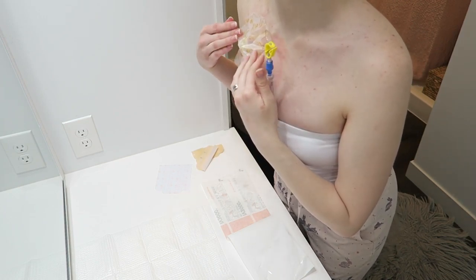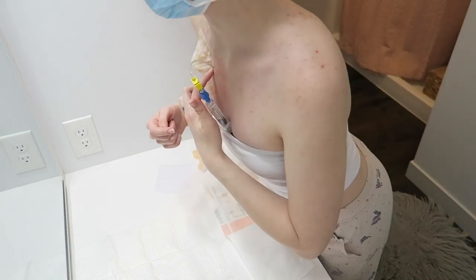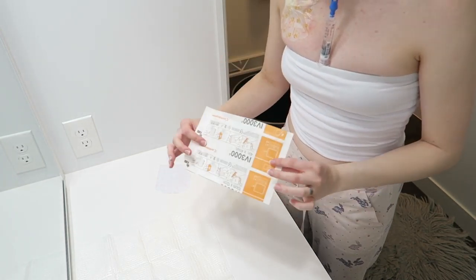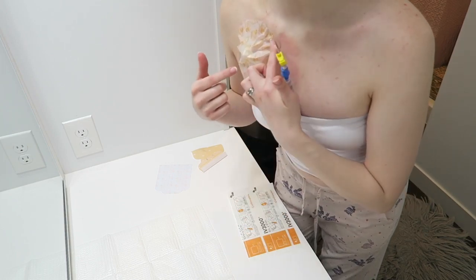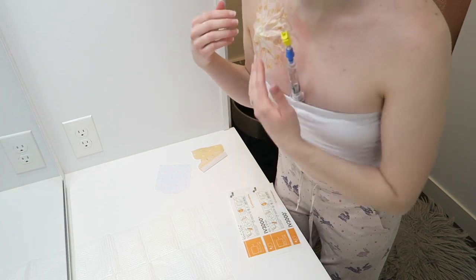I'm not super happy with how the dressing is around this tubing. It just didn't really go in my favor this time, but I do wanna purchase some more IV 3000 dressings in a smaller size so that I can put one right over this tubing area, because this is where the most pressure is and where it's most apt for the dressing to be peeled back.